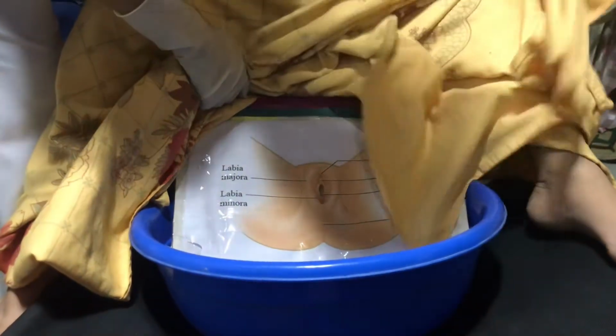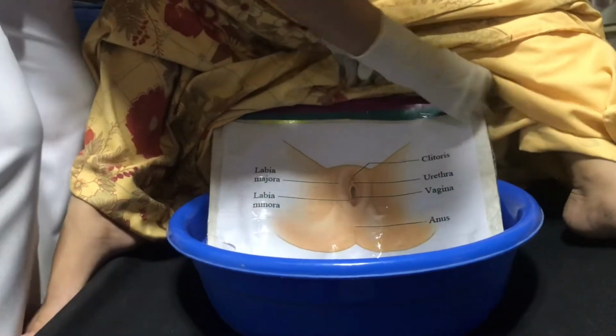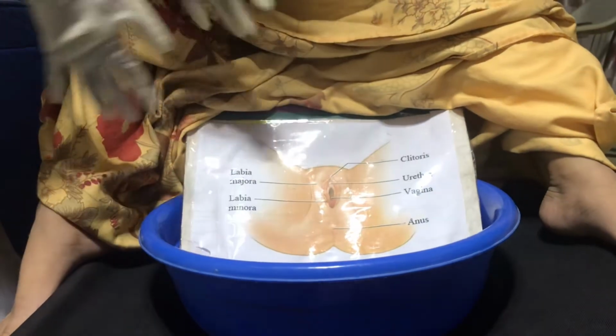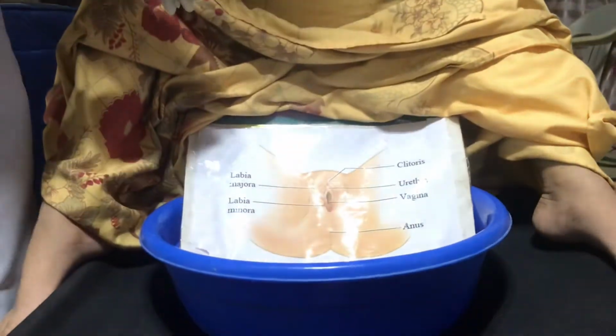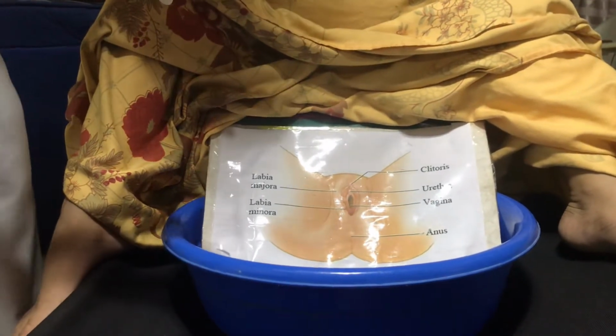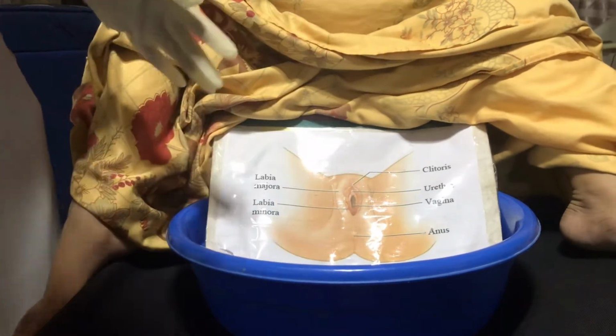So next is that we need to drape the blanket. The lesser the exposure, the lesser the embarrassment for the patient. So we need to cleanse, or flush, the perineal area with warm water.